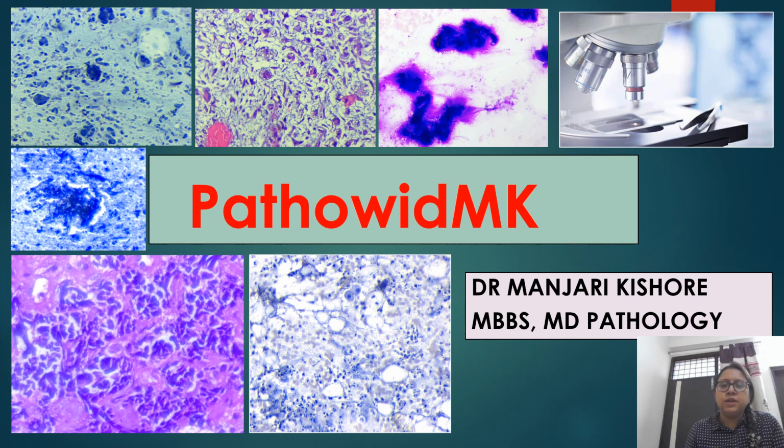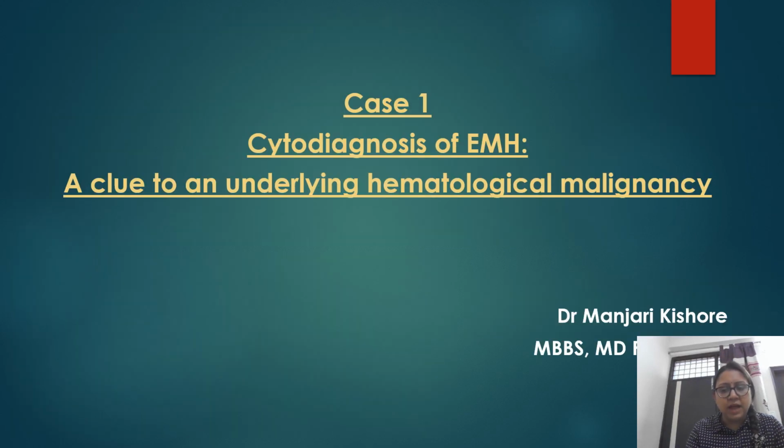So this is basically to tell you basic things: how you approach a certain case, and how you finally arrive at a diagnosis. This is basically a clinico-pathological integration in each case that I'll be discussing. So let's take it as case number 1.